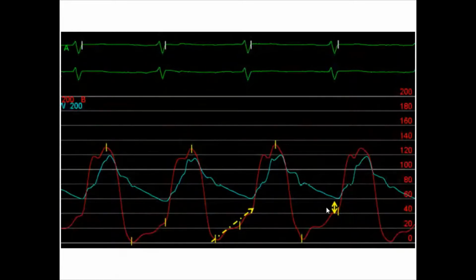In the aortic pressure, number one, we have nearly equal, or narrow, end diastolic left ventricular and aortic pressure. Yes, equalization of the pressure between the aorta and the LV. And the other thing, we have a marked increase and rapid rise of diastolic pressure.